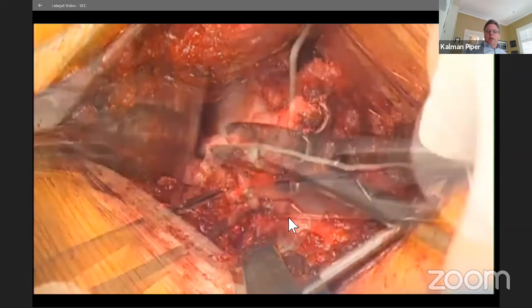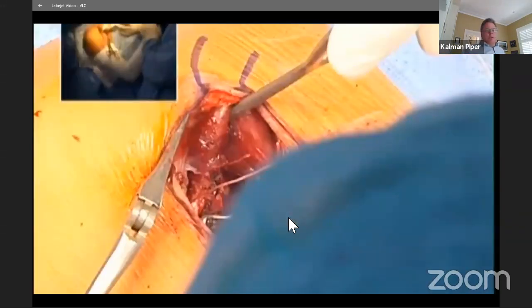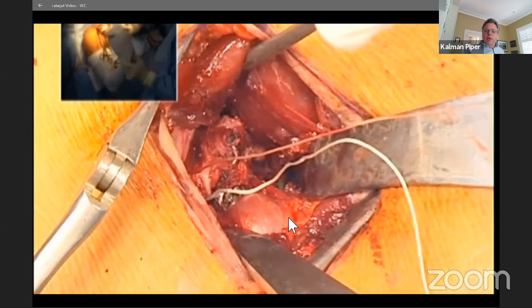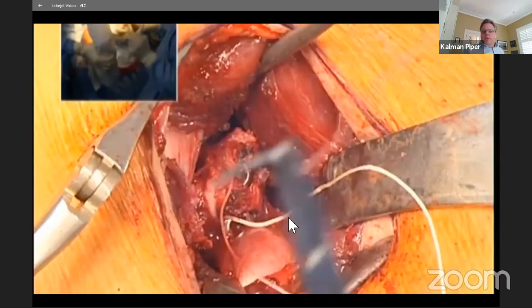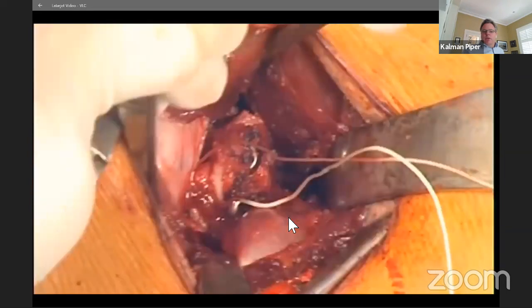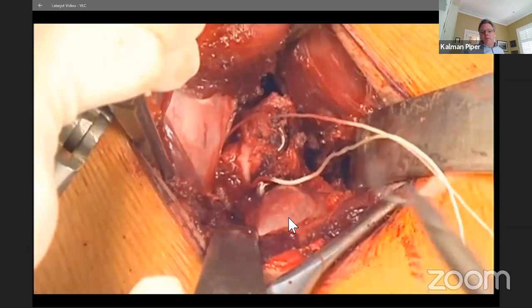This is the capsular repair at the end. Des, I think, uses suture anchors into the glenoid, which is another option. Or this technique I was taught by Jules and Laurent Lafosse for the open technique is sutures through the stump of the CA ligament and through the capsule.